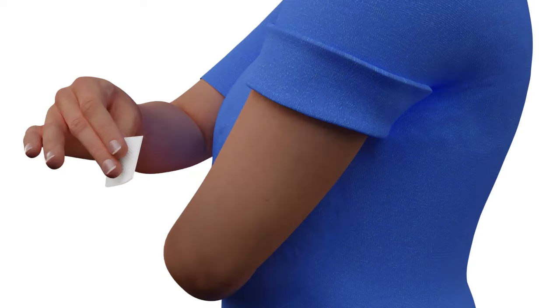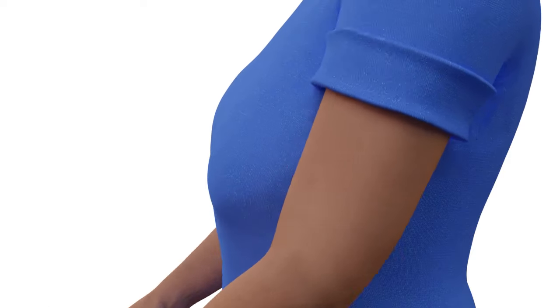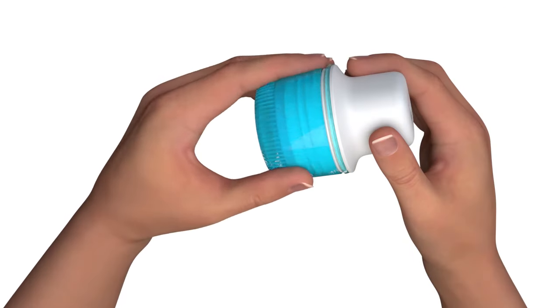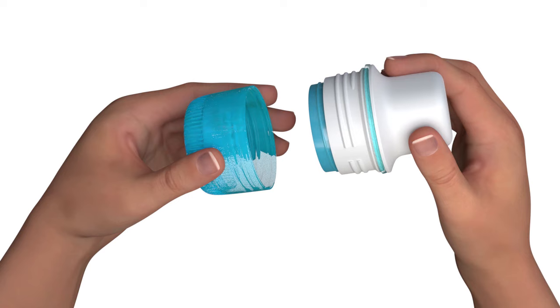Clean the insertion site with alcohol and let the skin dry before inserting the sensor. Remove the cap and immediately insert the sensor on your body. Do not use the sensor if it has been contaminated — for example, if you have dropped the uncapped sensor on the floor.